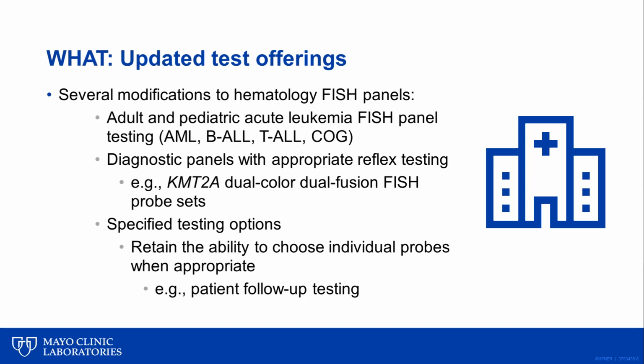We have also built our diagnostic FISH panels to include appropriate reflex testing. For example, if we detect a KMT2A translocation, previously known as MLL, we will run the KMT2A dual color, dual fusion FISH probe sets that are appropriate for the specific disease and patient age.